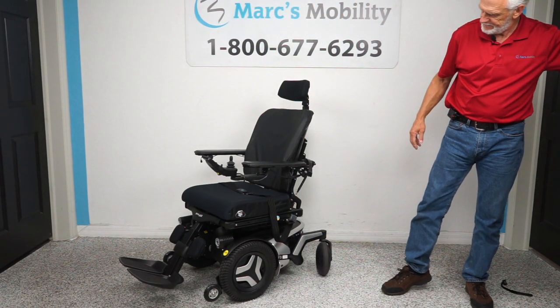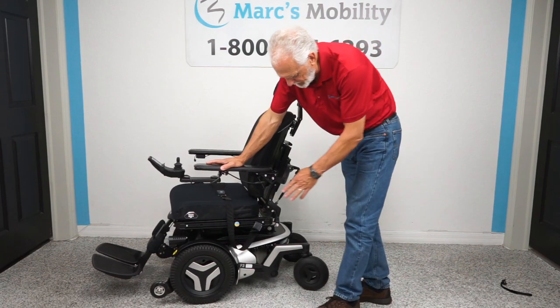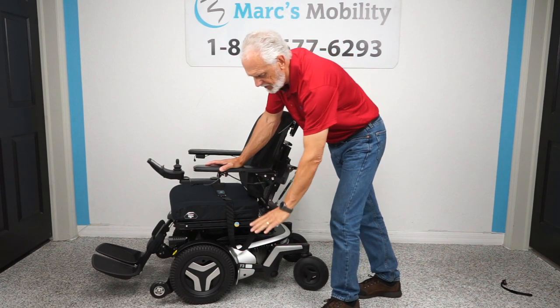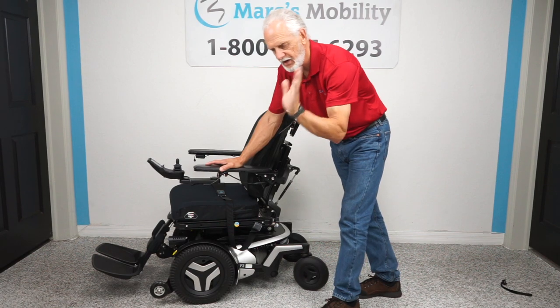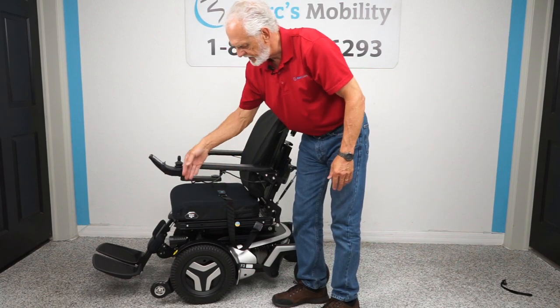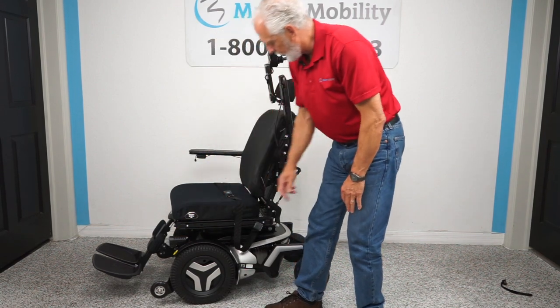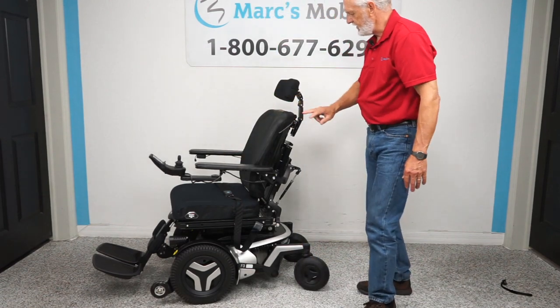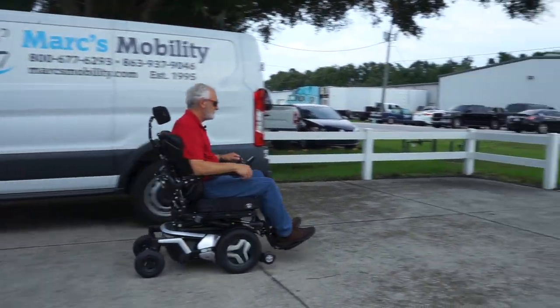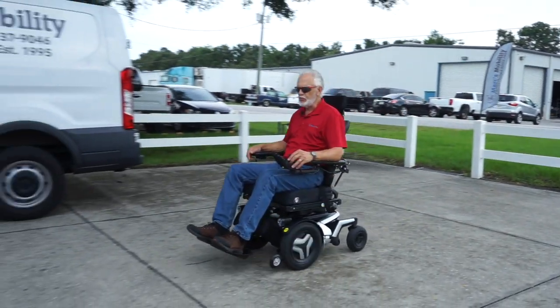Let's recap: we have a Permobil F3 metallic silver with two miles on it. Five electrical functions: 12-inch seat lift, electric tilt, electric recline, electric feet, and interior tilt. It has a swing-away joystick, flip-up arms, safety belt, factory lights, USB port, fully adjustable seat, and adjustable headrest. This is the Permobil F3 metallic silver power chair in new condition with two miles.